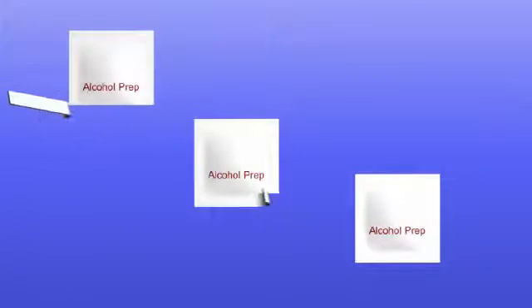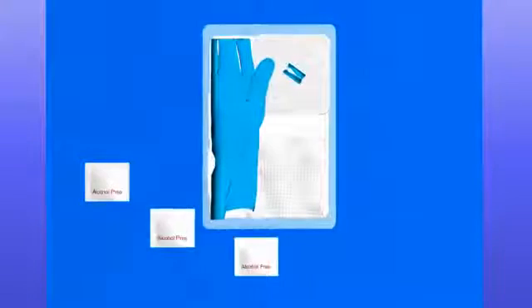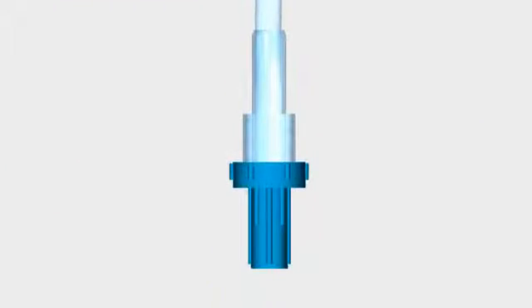Tear open the 3 alcohol pads, but do not remove the pads from the pouches. Place them on the blue wrapping. Remove the twist tie that holds together the drain line. Put the ASEPT bottle back on the open pouch. Do not remove the protective cap on the end of the drain line yet.